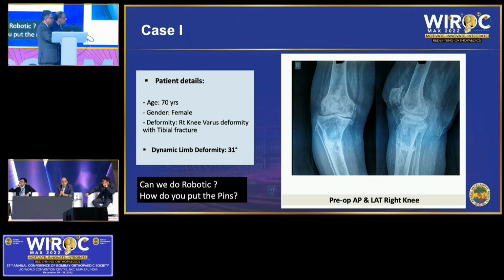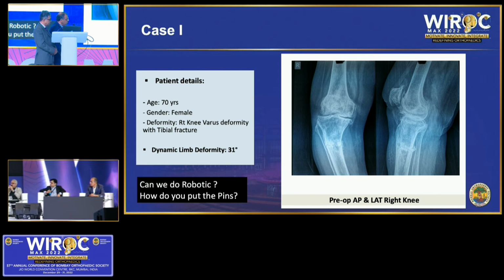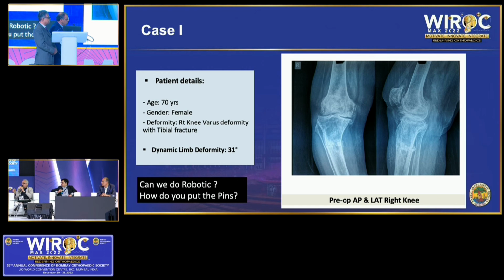Yes, Chandrashekar? So I have done stress fractures, which are like an impending stress fracture where I could still put in my pins and then remove the pins and put in a stem extension. But if it's a fresh fracture which is mobile, I would rather not go for it. I have done a couple of them even with navigation, but once robotic, if it's a mobile one, you give a stress, make sure when you're morphing it, it's stressed properly, and you can still achieve it. And the rest of things can be done by the intramedullary stem.